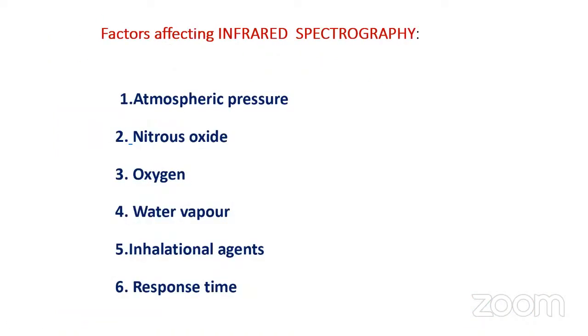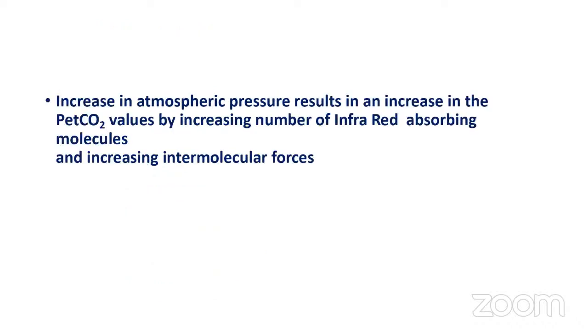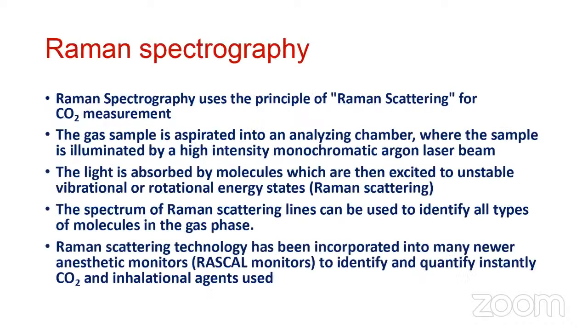Factors that affect the infrared spectroscopy include atmospheric pressure, nitrous oxide, oxygen, water vapor, inhalational agents, and the response time. Increase in the atmospheric pressure results in an increase in the ETCO2 values by increasing the number of the infrared absorbing molecules and increasing the intermolecular forces.